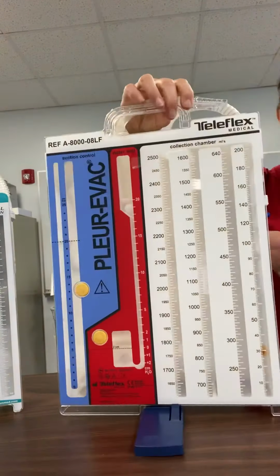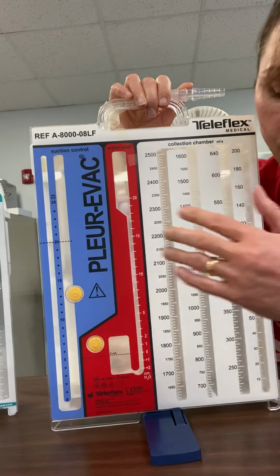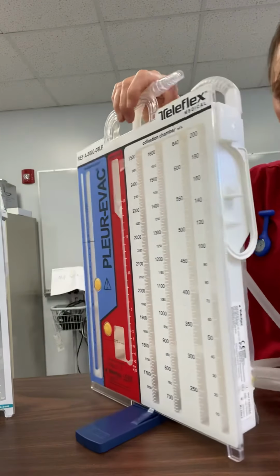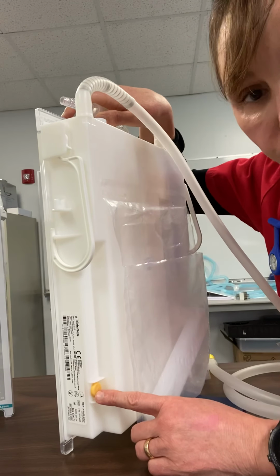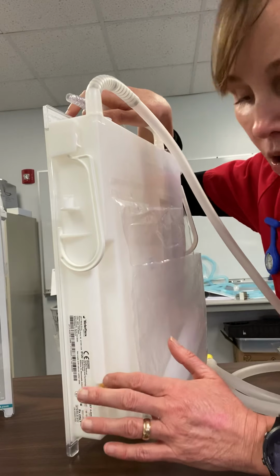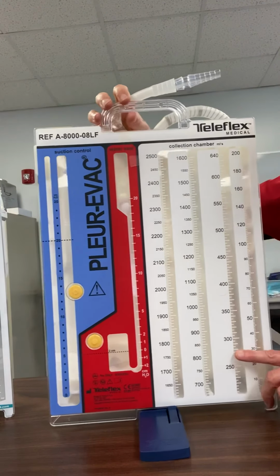Once it fills, you need to change the whole system. We never empty anything out of this system. It's a closed drainage system. That's to prevent infection, obviously. Now, if you do have to get a sample, there is a sample point back here. If your physician wants to run a culture or something on your drainage, you can get one back there. So that's an option.